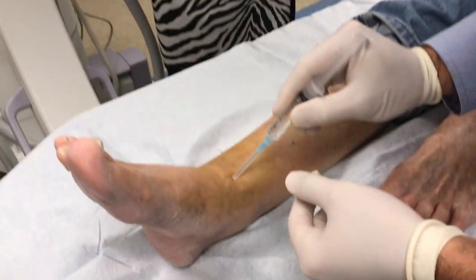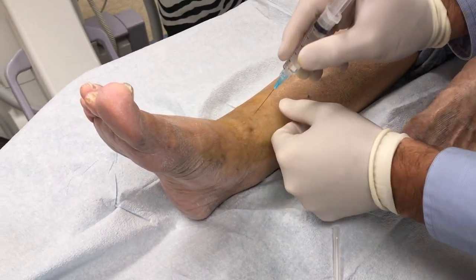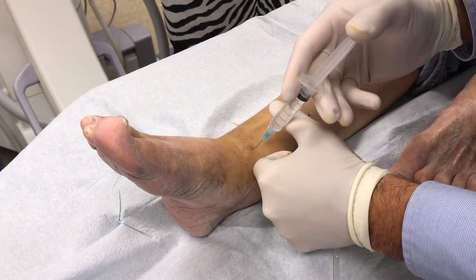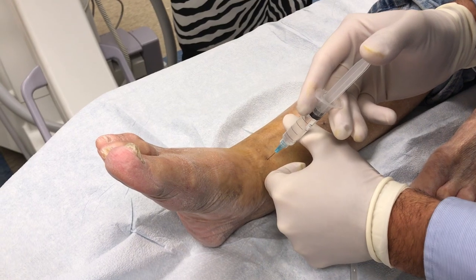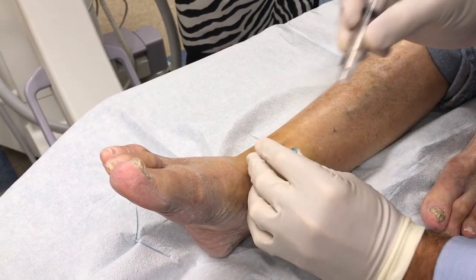That's where I want to go, right there. Feel a little pinch on three — one, two, three, and pinch. Go down slowly so you don't plunge into bone. I can inject slowly five cc's of one percent lidocaine. I can feel myself against the bone there, so I'm going to uncap and take an X-ray.